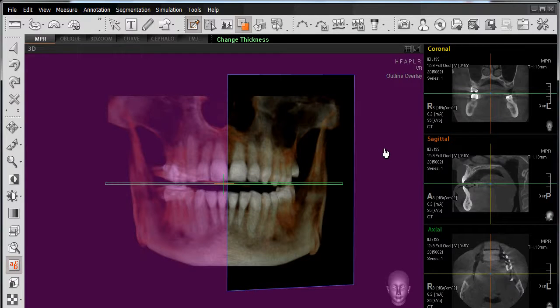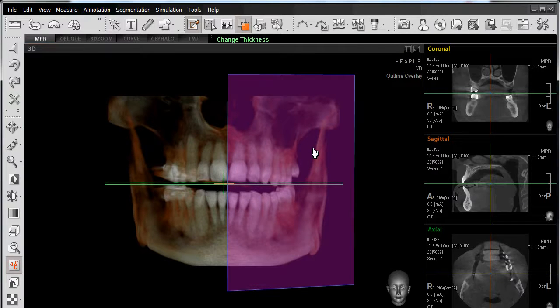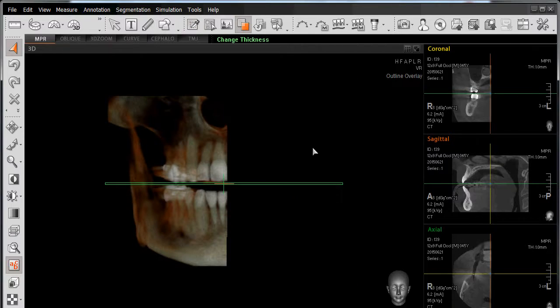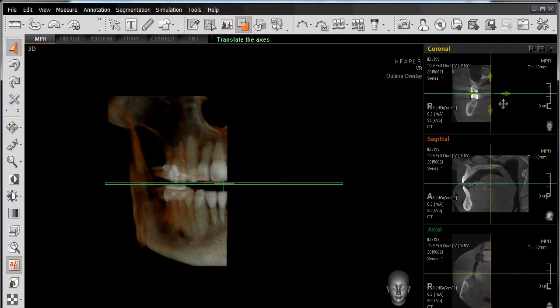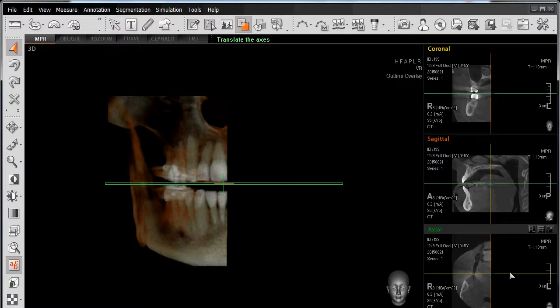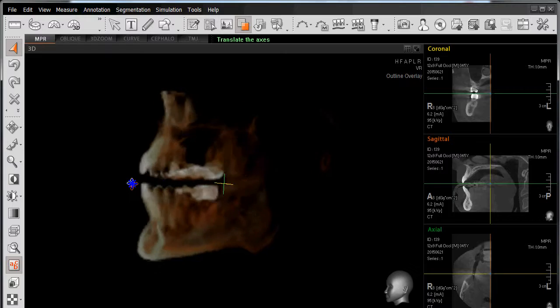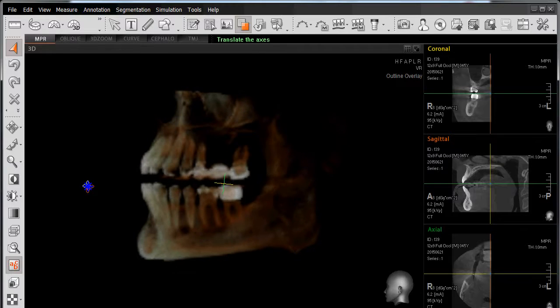As I now hover my mouse inside of this box, if I left click, this area will then be masked. However, if I left click out here, then the right hand side of the arch will be masked. So let's go ahead with our original intention to hide the left hand side. As I left click, I've now masked that anatomy from view, as indicated by my coronal view and my axial view. As I right click my scan, you can see I'm viewing only the right hand side of my anatomy here.